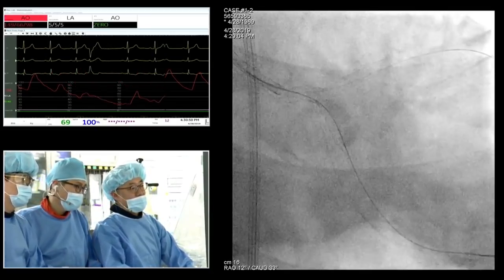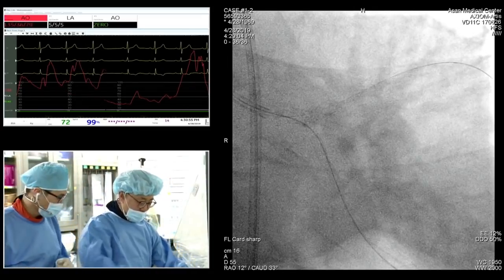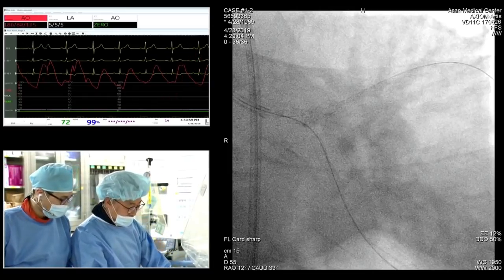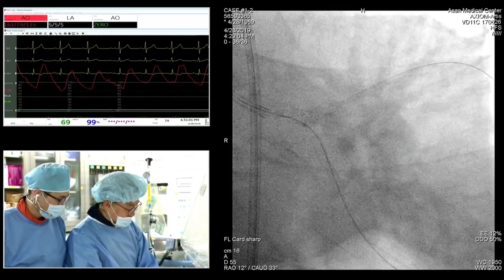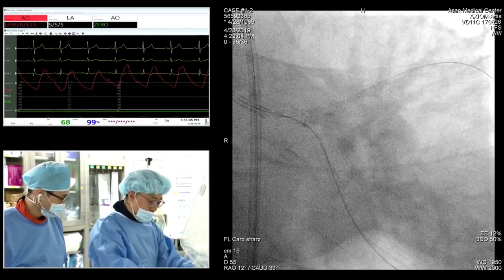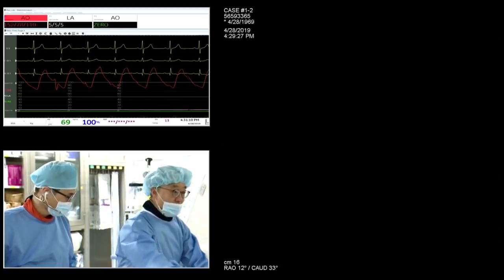Okay, we're going to check the angio and IVUS again. Finally, after kissing, do you do the second part before? Yeah, there is a very nice comment. Is final rePOT after checking the IVUS, depending on the IVUS configuration, we decide additional rePOT or not.